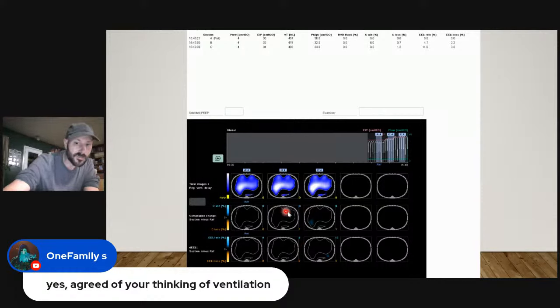What I saw was not much of a difference. There was no win or loss. There was a slight gain. If you look over here, it goes compliance win, it says 0, 6%, and 9%. The 9% is starting to show up over here, and I can see a little spot of blue there. So technically, comparing 30, 32, and 34, 34 would be optimal. But I left it at 30.